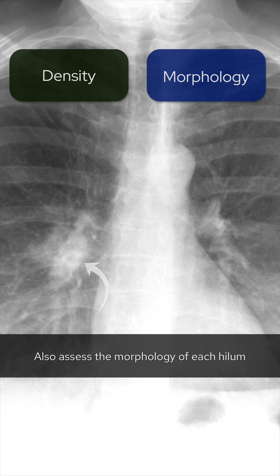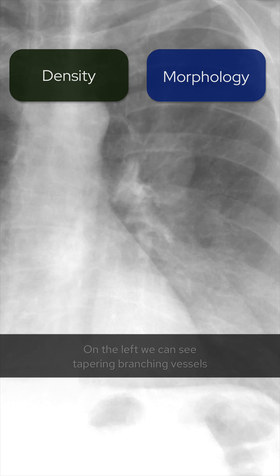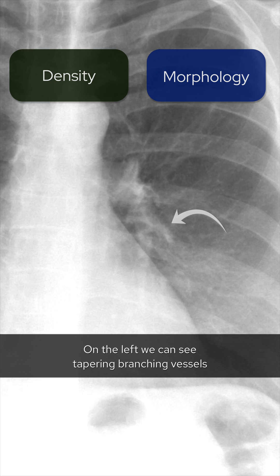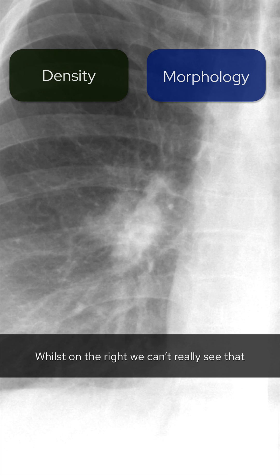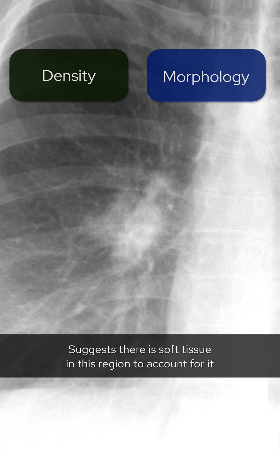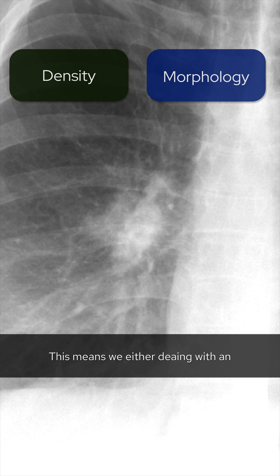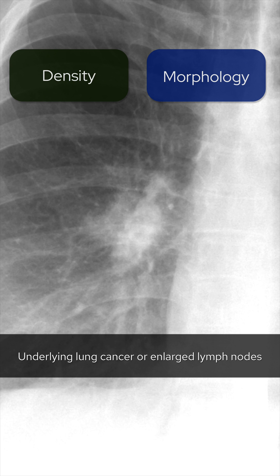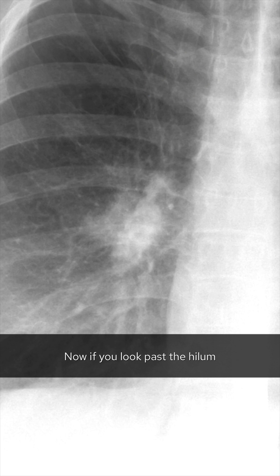Also assess the morphology of each hilum. On the left we can see tapering branching vessels, whilst on the right we can't really see that. Increased density plus this abnormal morphology suggests there is soft tissue in this region to account for it. This means we're either dealing with an underlying lung cancer or enlarged lymph nodes.